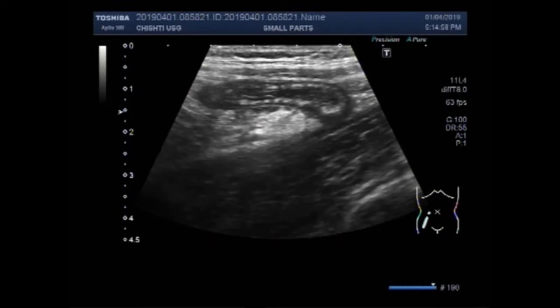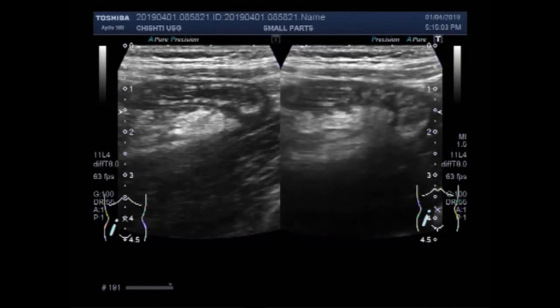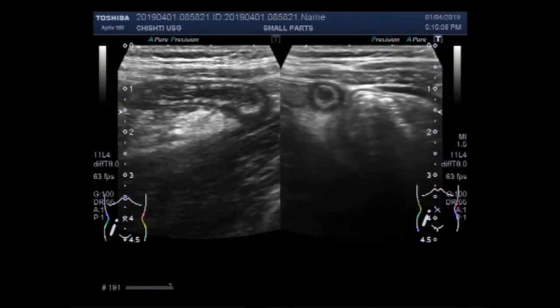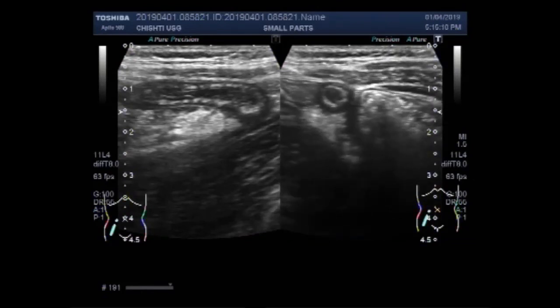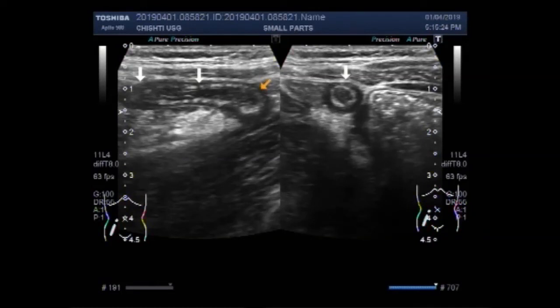Now this is the transverse view of the appendix. And again, this is the vertical view — the longitudinal view of the inflamed appendix.